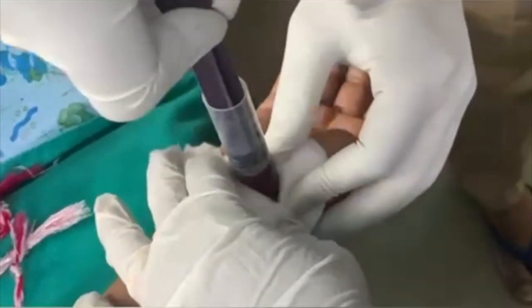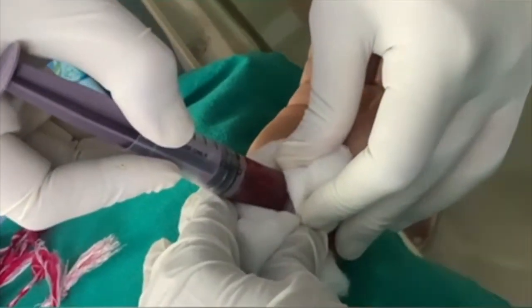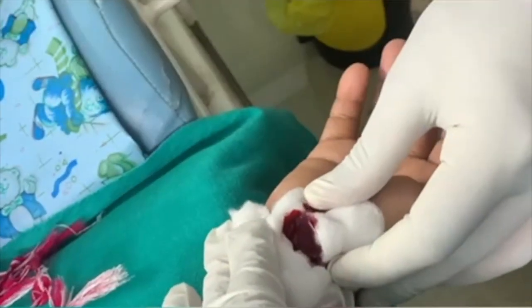After the procedure, we can check the Phalen's test again. 50 to 80% relief will be there immediately after the procedure.